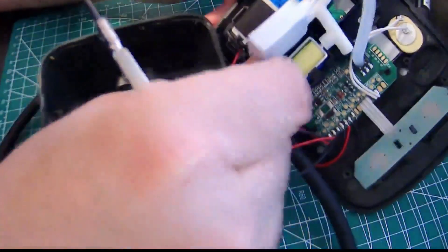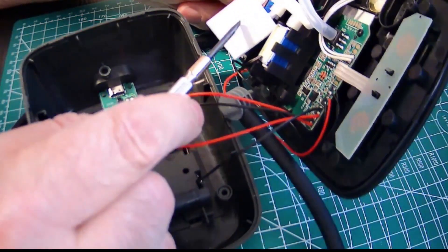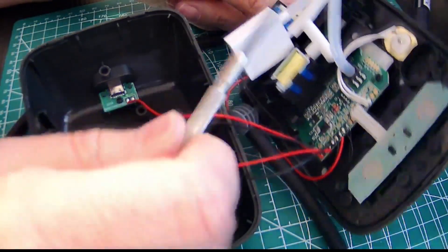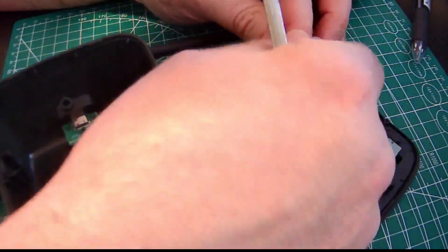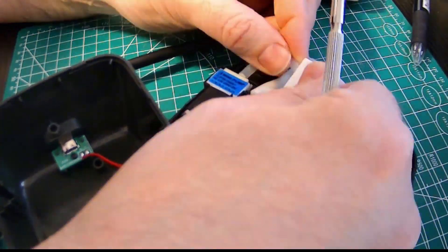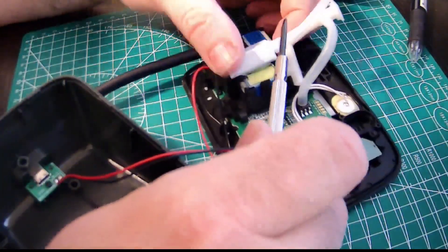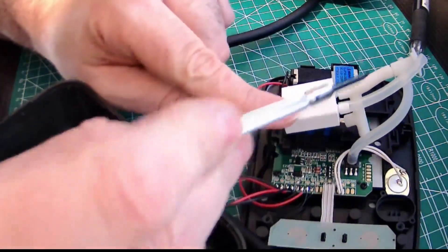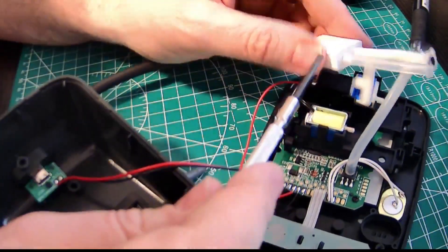Unless this actually is not a valve — I believe this is just a manifold where the air gets distributed, for convenience. And this is actually the solenoid valve, the air valve. Definitely this is the solenoid valve, and this is just some type of air manifold.